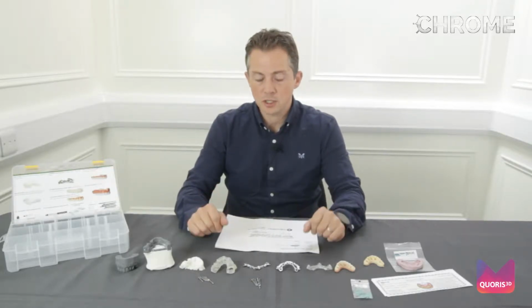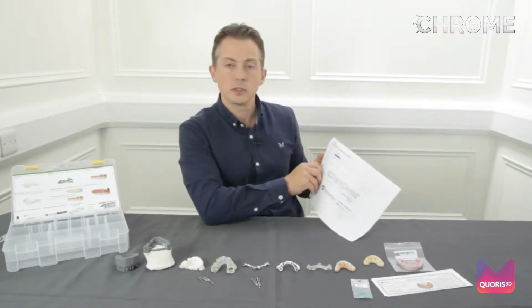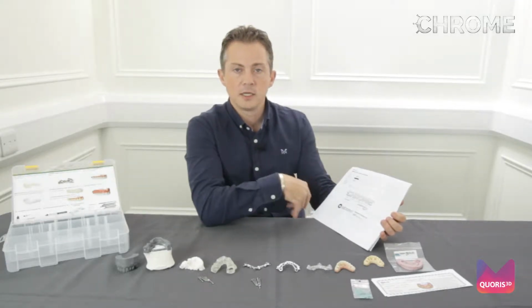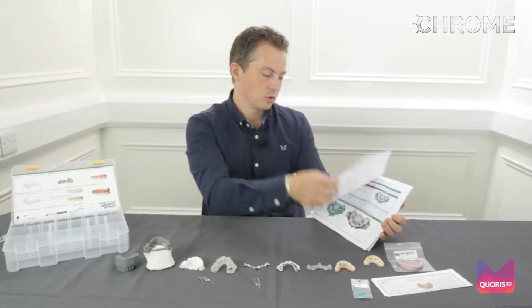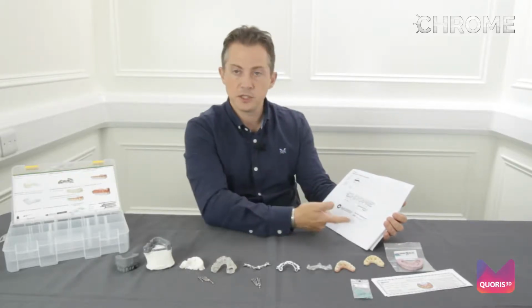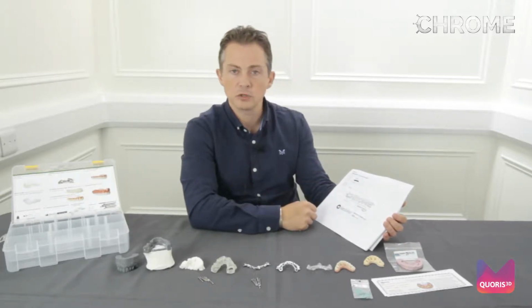The very first thing you get is a PDF document, and the PDF document basically outlines for you all the stages of your surgery, and it's important prior to going ahead that this is checked by both the clinician and the nursing staff. So what we have here is obviously the title, the fact that it's a Neodent case with a Neodent guided kit and the GM implant line. So whatever implant system you're using, it will be noted on the front.